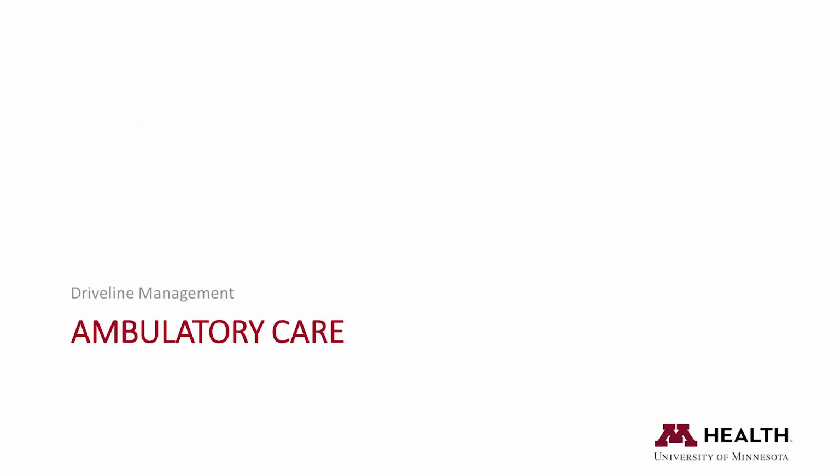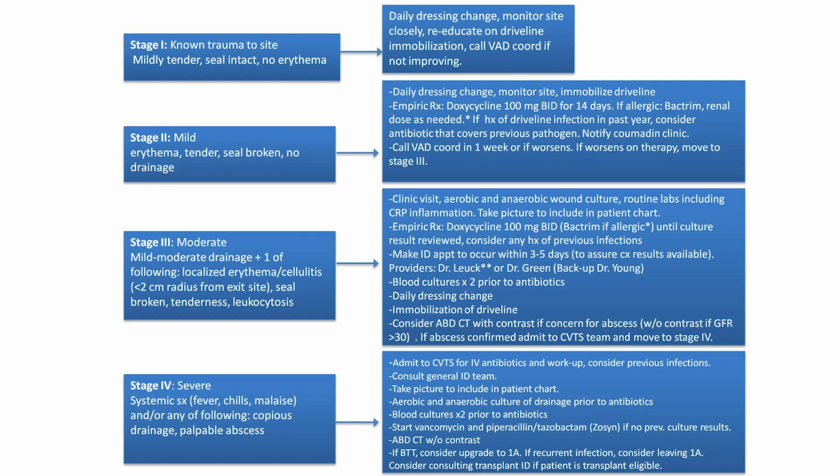Also, at every clinic visit, you're going to do driveline management. Another busy slide. Basically, at our site, we do a daily dressing change, and we require that the patient has a caregiver do their dressing changes using sterile technique. I know that's different everywhere, but we do a daily dressing change until the driveline site is completely sealed. It should look like a belly button with a tube coming out of it. And once it's sealed, we transition to a weekly dressing change with a clear window.